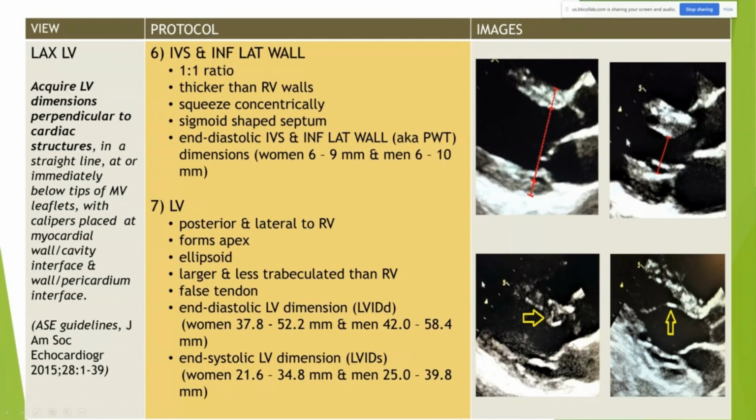We don't want that. So the vertical arrow that you're seeing right here is a left ventricular false tendon. It's a cord-like structure, but it'll never be attached to a valve, just so you know. It's usually attached to the septum and the papillary and the free wall, but it's never going to be attached to a valve. That's what you need to remember about that.